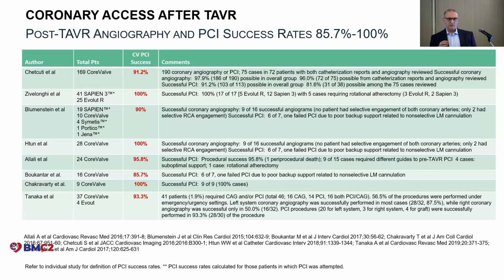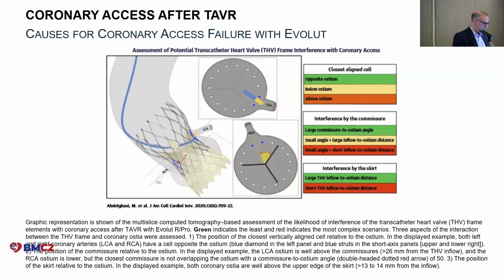Coronary access after TAVI, we all remember the one nightmare case, but if you look at a number of studies now, it is, as I alluded to, a very teachable event. And it's embarrassing to say that the one paper I was in charge of, we had one of the lower rates. Just to put things in perspective, this was 2015. We knew nothing about how to engage coronaries. This was in a pivotal study with CoreValve. A bunch of us went into a room in Minneapolis airport, looked at all the studies and saw what people had done. From that initial event, we created best practices as to how to engage coronaries, and I'll defer to my colleague here afterwards. We'll probably go more into that.